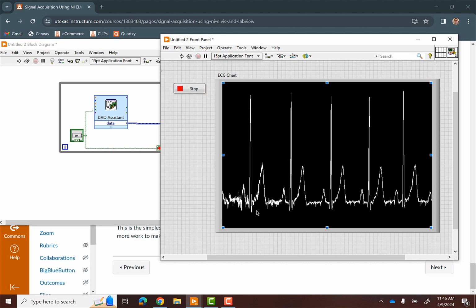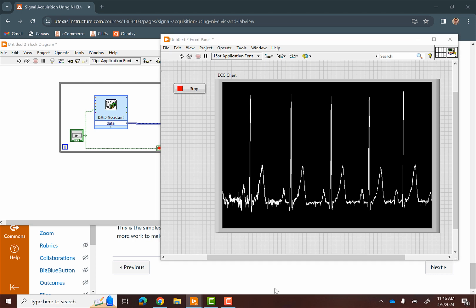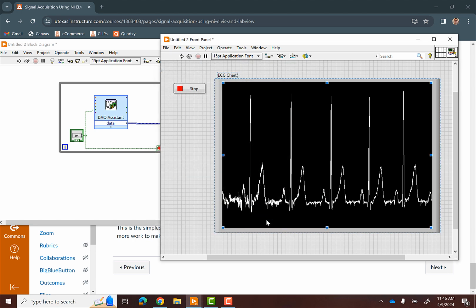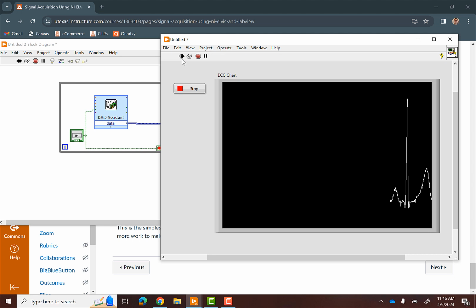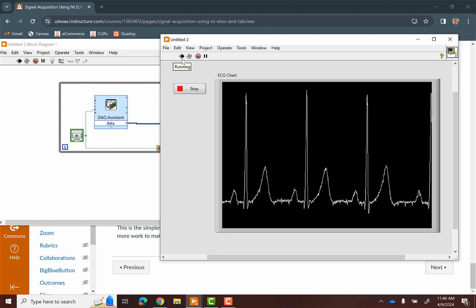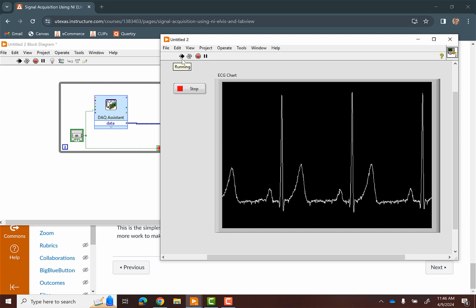Okay. Last thing is, if I wanted to change, again, the X scale, like right now it's 5 seconds. I'm just going to change this to 0 to, maybe I only want 3 seconds, 0 to 3, right? And so I'll run it. Right, so now it's a little bit shorter. You can make it longer if you wanted more peaks on there.